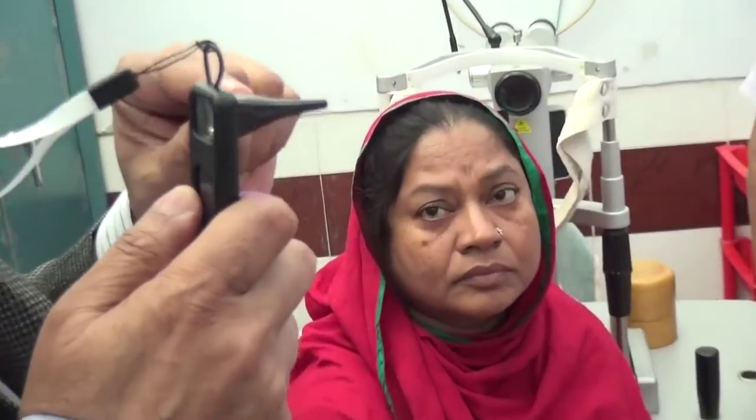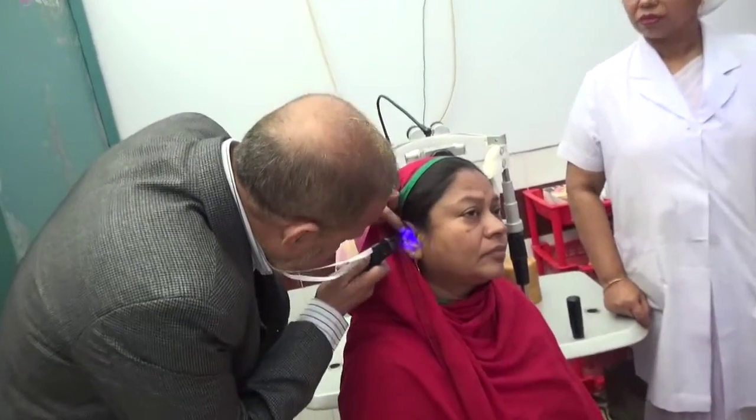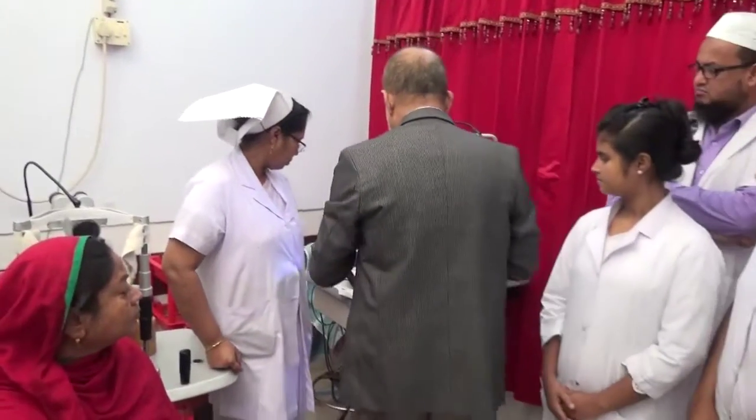If I want to see the external ear, I must use this speculum. There are two specula — one is big for adults and one is small for children. I can see the external ear and middle ear with the speculum, and I can change to the smaller one for little children.